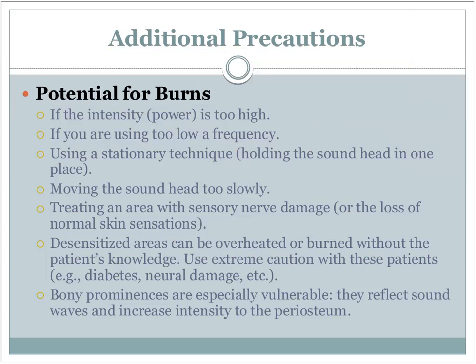Additional precautions, there is potential for burns. I'm going to say this is pretty low. In my 17 years as a PT, I'm trying to think of a single instance that I even heard of a therapist creating a burn with ultrasound. I think, if anything, we are overly cautious about it because we hear about it and it gets drilled at us. The intensity has to be too high, too low a frequency, and we're going to talk about frequency in a minute because that is an important piece.